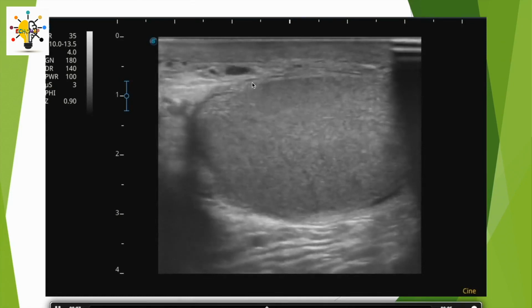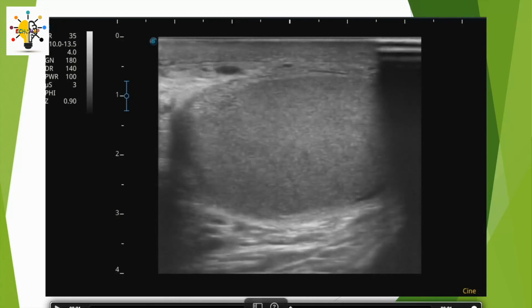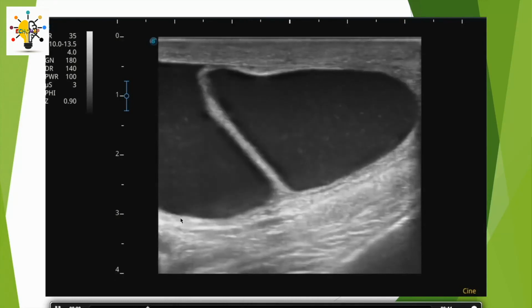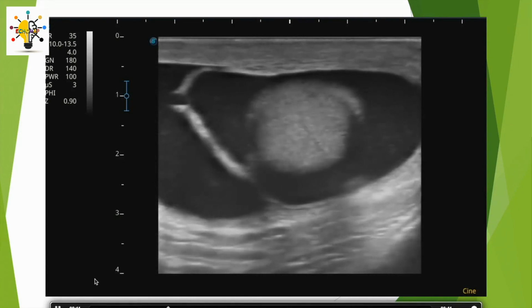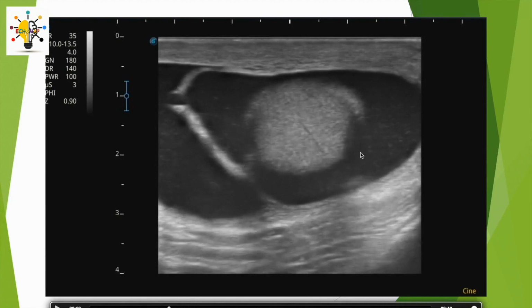This testicle you notice here is easily visible, easily explored. Let's go back a little because I wanted to show you something else. An uncommon occurrence: it's about finally being able to see the body and tail of the epididymis. Usually, it's something virtual that you can't see. Here, you can see it. So that must tell you that there's probably something there, in any case an anomaly on the epididymis.